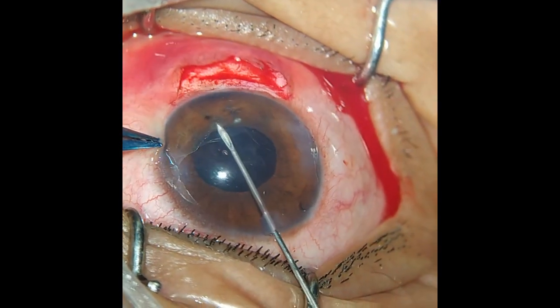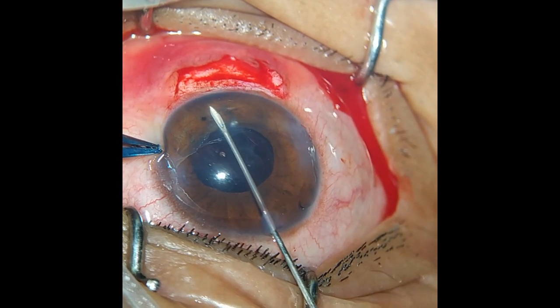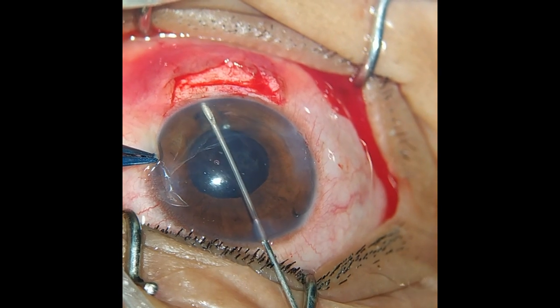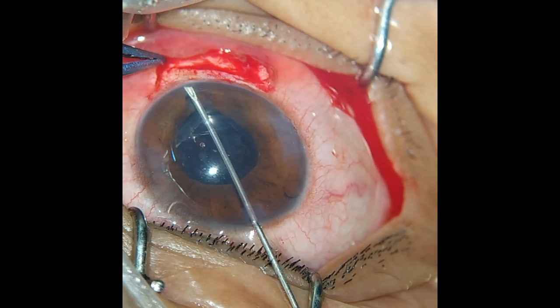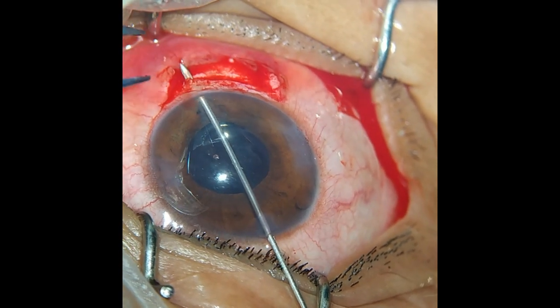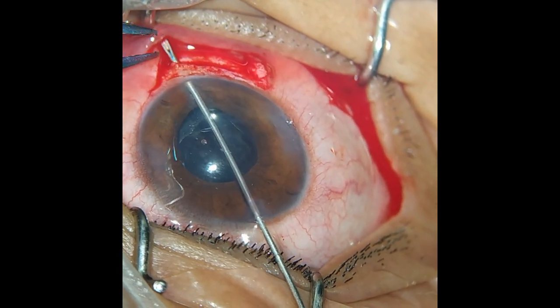The needle is used to take a bite of the iris root and exits the eye via the scleral tunnel. Forceps must be used to support the sclera at the tunnel site for easy exit of the needle.